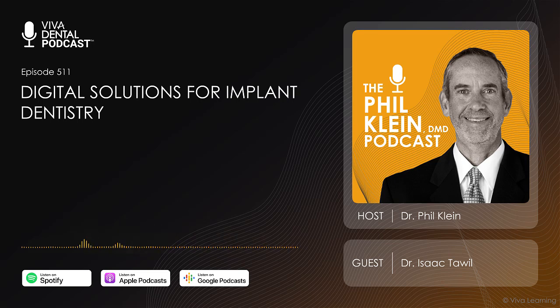We'll talk about that too. But the most important thing to me is that I want to be able to capture everything in an arch. I want to be able to use artificial intelligence to block out the lip and cheek. If I have the tongue captured, it should automatically erase it, so I don't have to worry about that. Some of the scanners, because of their software, have that incorporated.